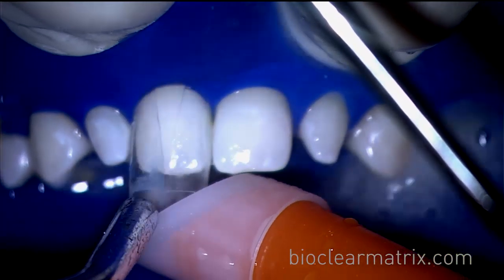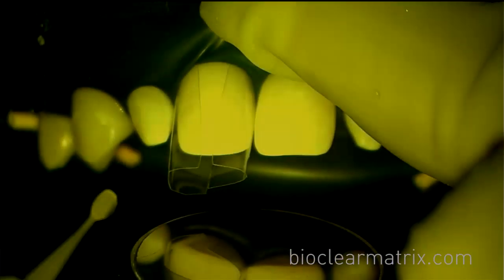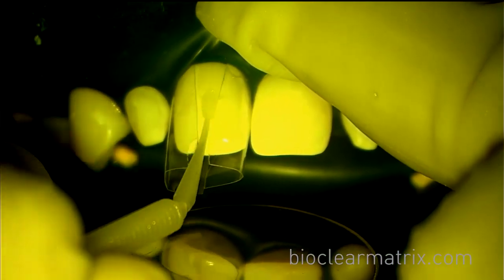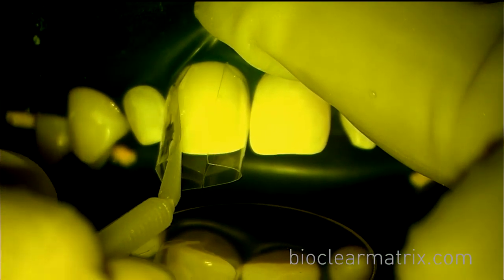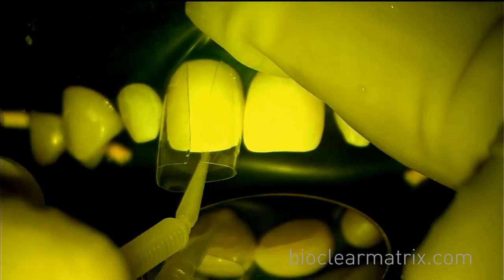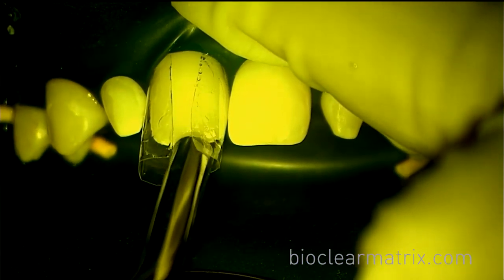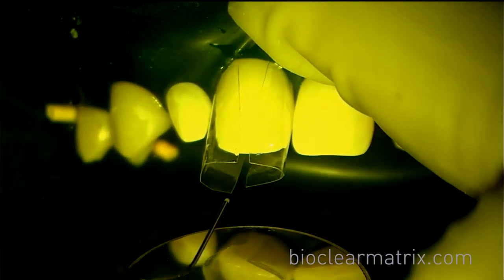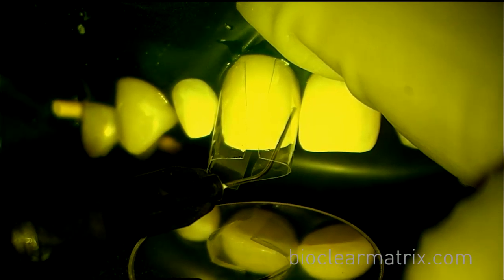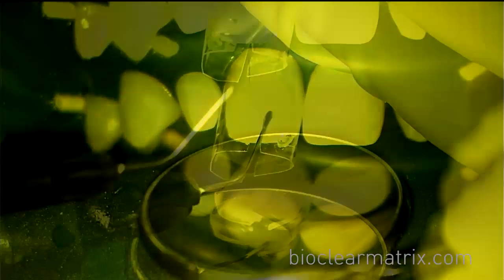We then rinse away the etch and thoroughly dry the tooth. Now we'll start the steps of injection molding. Massage the adhesive onto the tooth, being sure to thoroughly cover all areas of the tooth. Air thin, then insert the tip of the heated flowable composite apically and inject the heated flowable into the inner proximal areas facially and lingually.